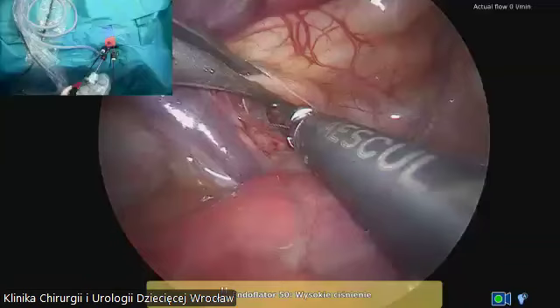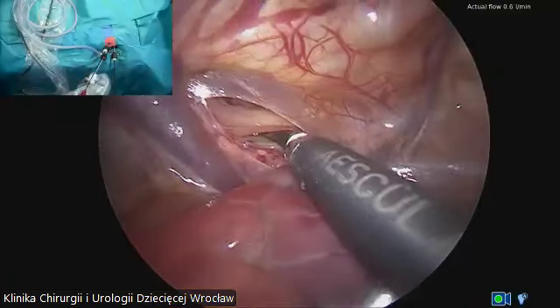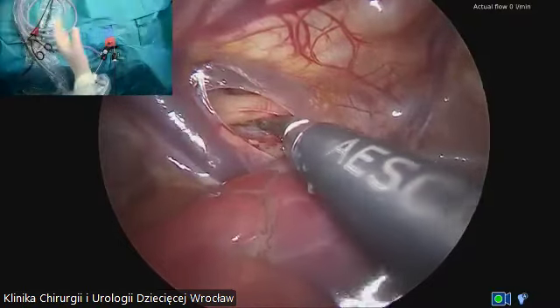You repeat what is the reason of your strategy of closing only the fistula. Yeah, the baby is not doing very fine. So this is why we decide to do it in stages.